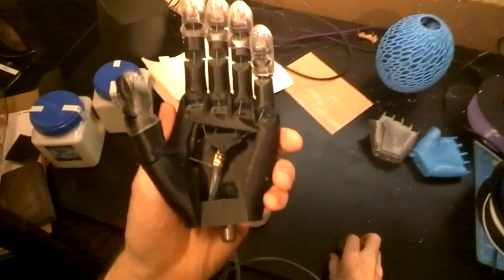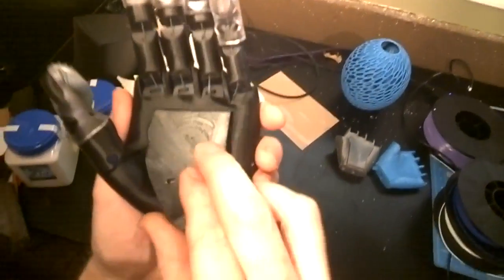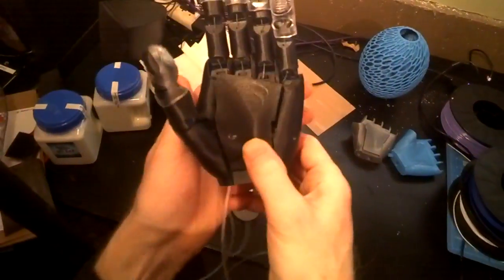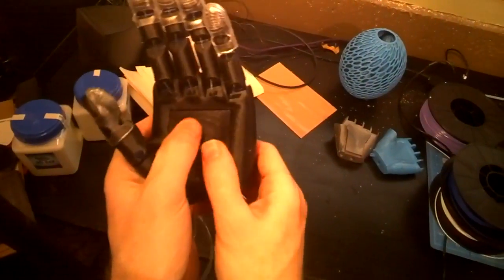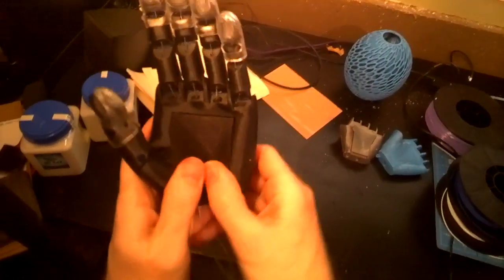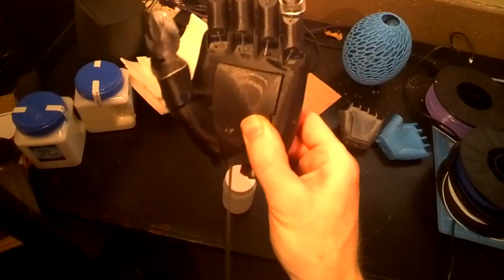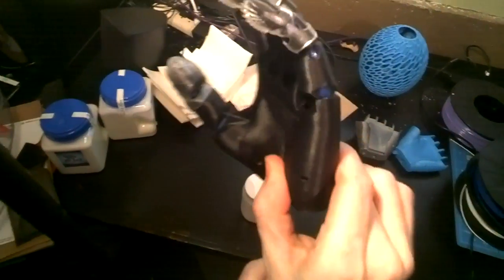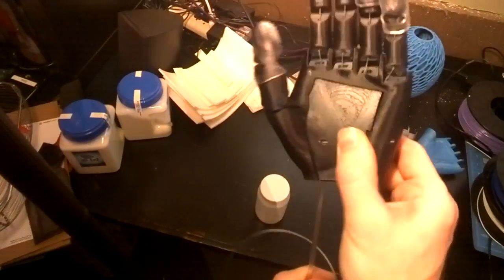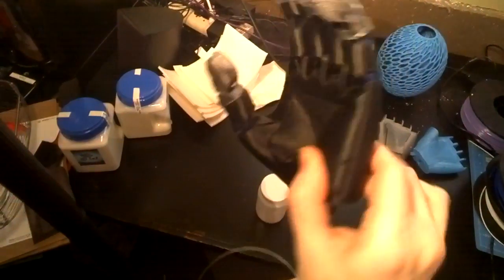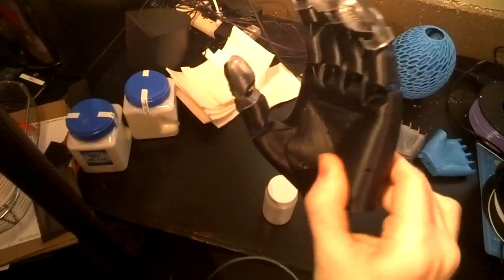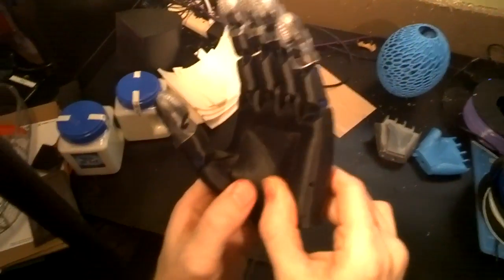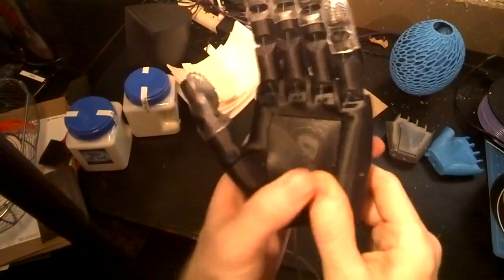And of course, then it has a nice cover and secures in place. I don't have that secured right now, but that gives it a nice look just like the original FlexiHand and covers up those inner workings.